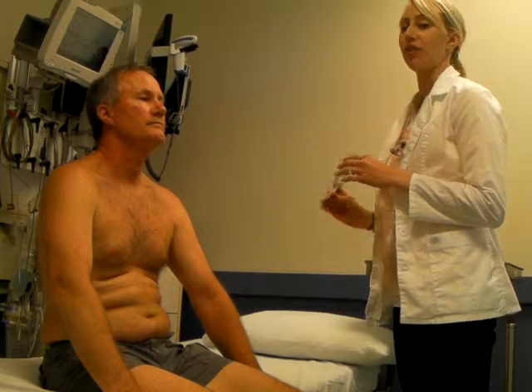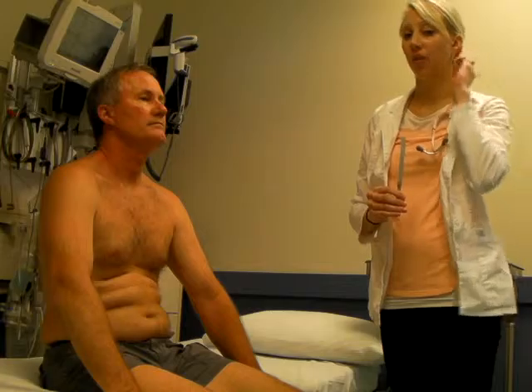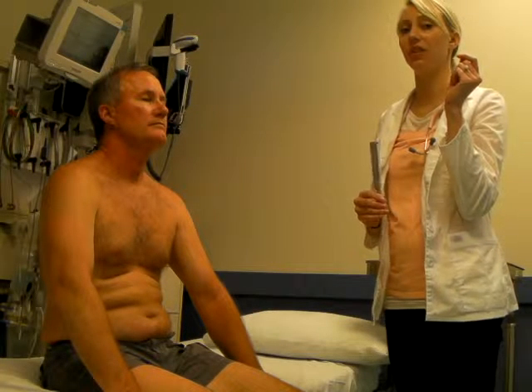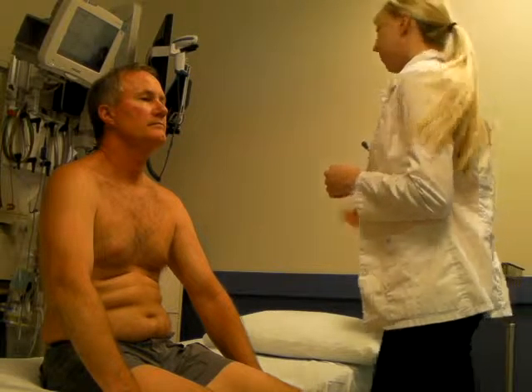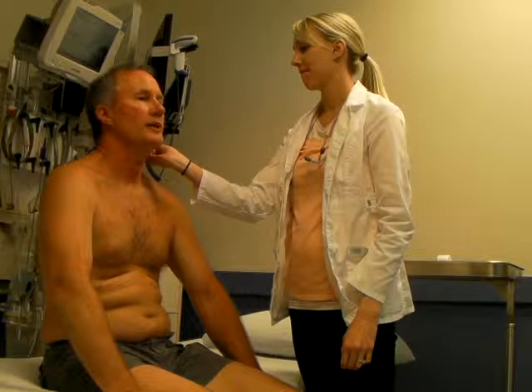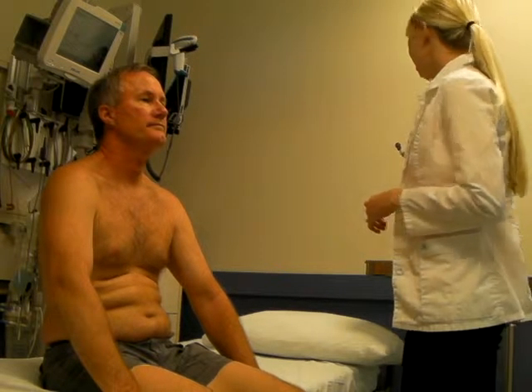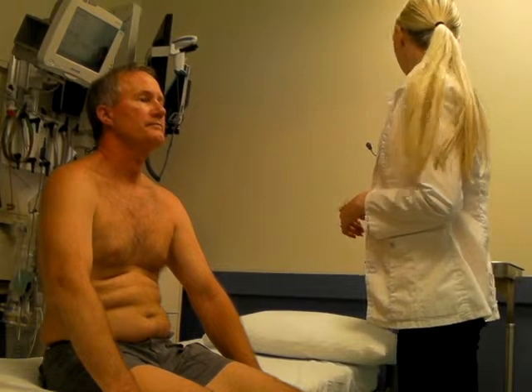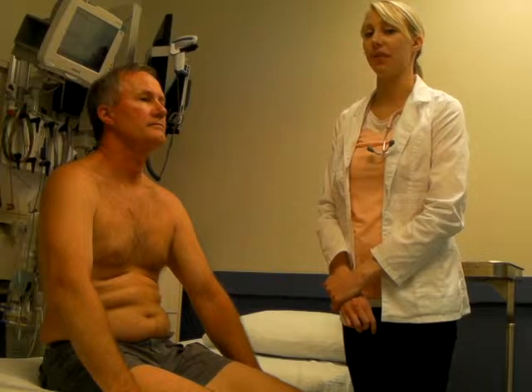Next, I will perform the Rinne test. I will strike my tuning fork and place it on the mastoid bone. I will have him tell me when he can no longer hear the vibration and move it in front of his ear, and once again tell me when he can no longer hear the vibration. Now. Now. Great. And that is a normal finding, as air conduction should be twice as long as bone conduction.